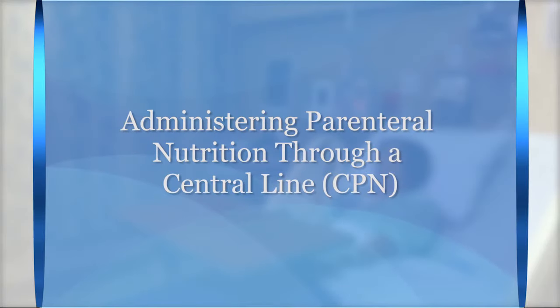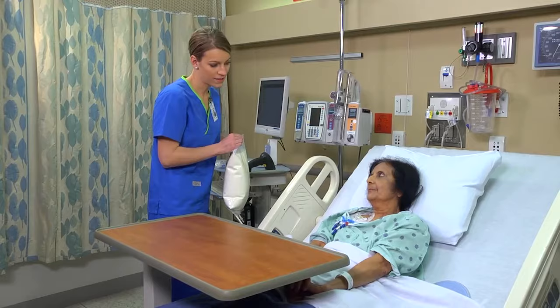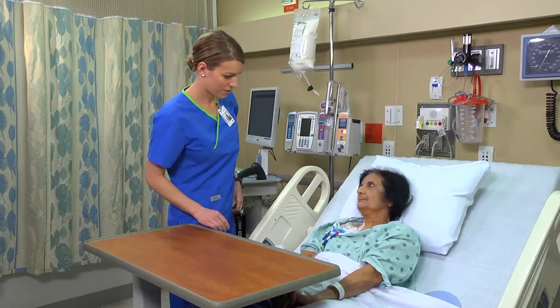Always perform hand hygiene and provide for patient privacy before beginning patient care. To administer central parenteral nutrition, or CPN, first introduce yourself to the patient. Then identify her using two identifiers. Can I have your name and your date of birth?